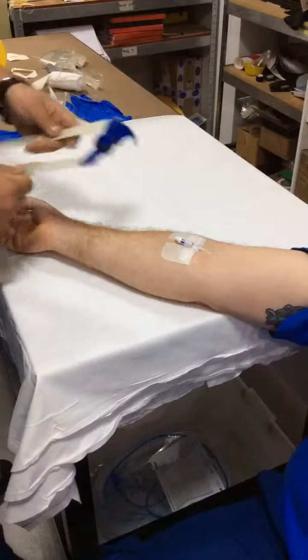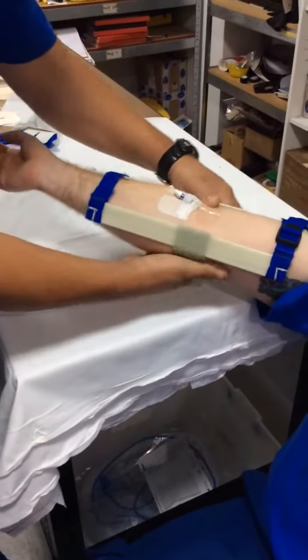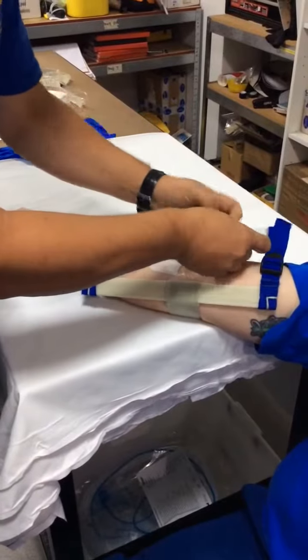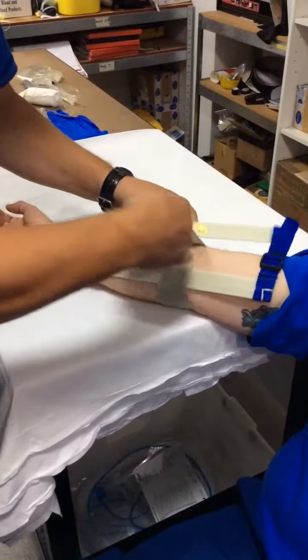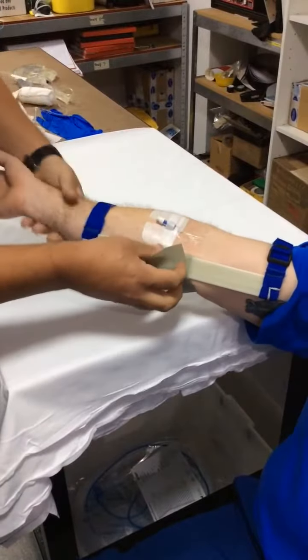Secure it as per local protocols and procedures. An arm lock splint can be a godsend — use it to your advantage. That will take the mobility out of that limb.